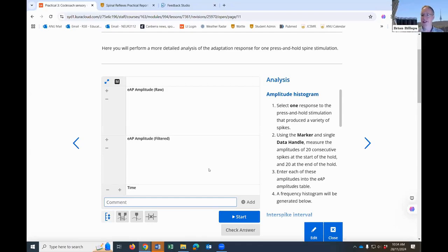No. So the issue is, if you know about visual evoked potential, we've got one electrode on the front, and we've got an earth electrode somewhere. For the electrode on the back of the head, what we say is you find the inion and then you go down, I think a couple of centimeters, and that's where you put it. The problem with that is that the electrode moves up and down. The signal will change from being an outside one to an inside one.